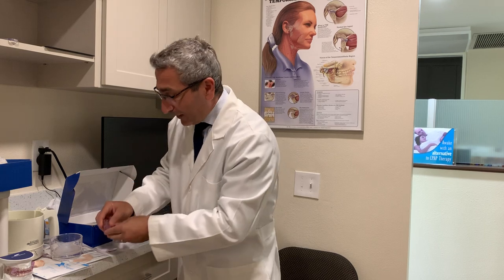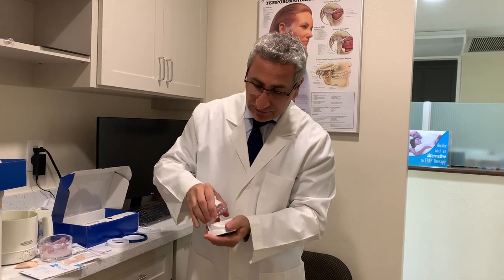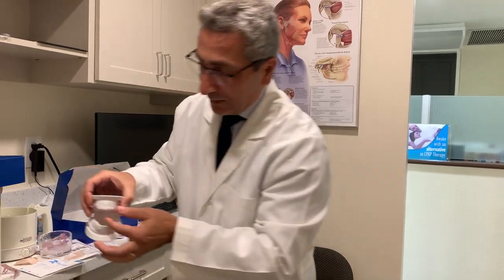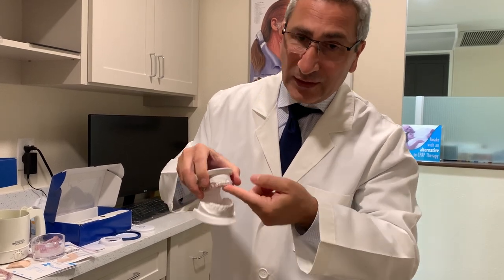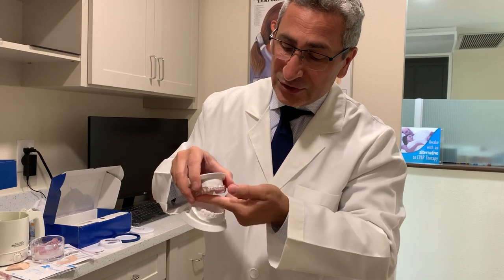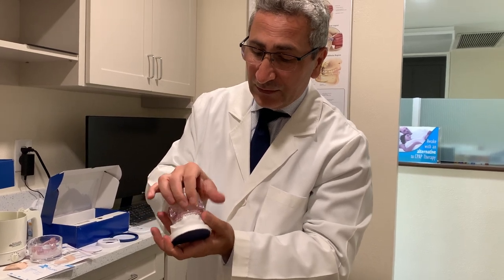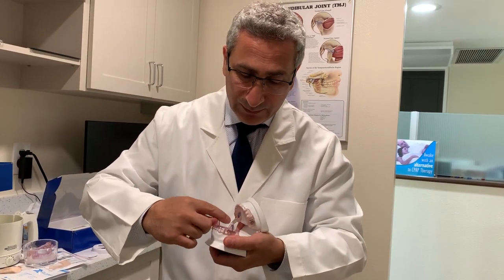Your sleep appliance has two components: an upper component and a lower component. When putting in the mouthpiece, always start with the upper one. Put in the front teeth first. Because our teeth are angled forward, line up the two front teeth, push the front in first, and then with your thumbs push the back in. Then go to the lower part, line up the front teeth, push the front in first, then with your index fingers push back and bite into it to make sure everything comes together.